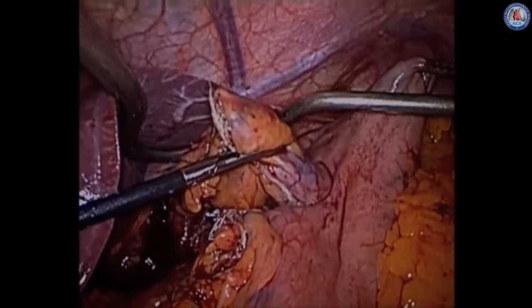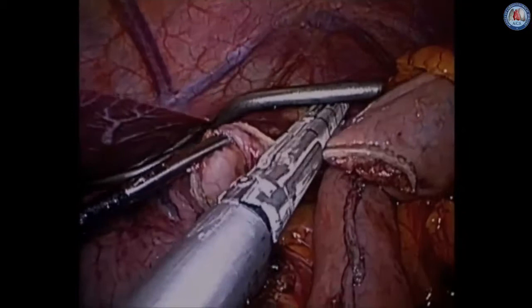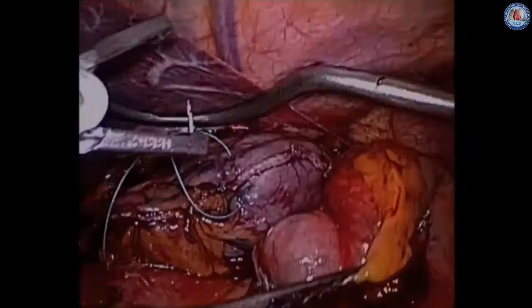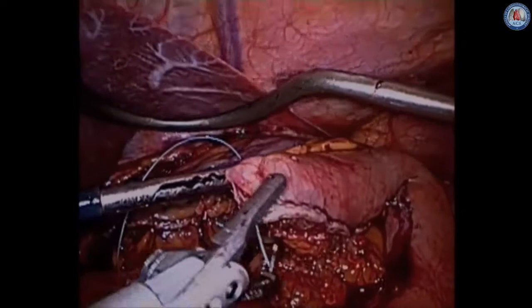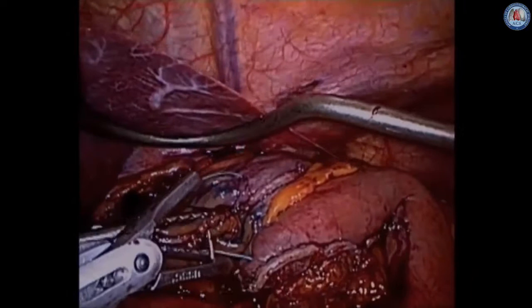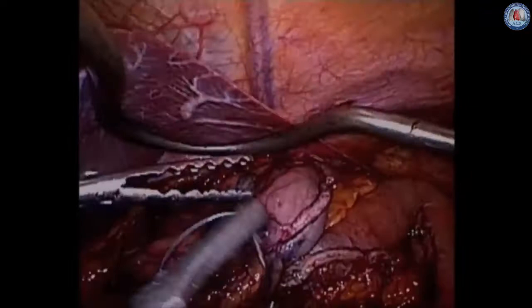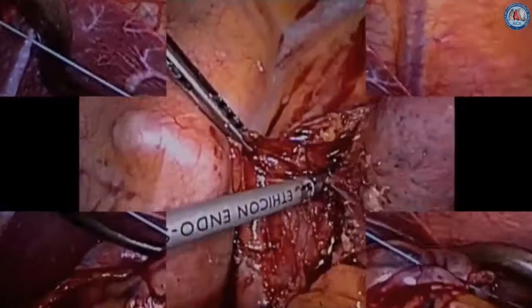We form our gastric conduit in multiple fires of the stapler, making sure we have about a 4 cm diameter from the greater curvature wall to our staple line. We put some retraction on the stomach to make sure that the conduit itself is extended. Usually it takes about seven to eight staple loads to go across the entire length. We then attach the specimen to the tip of our gastric conduit, making sure of the orientation so that the staple line remains on the right side, verifiable once we pull it up into the chest. Usually two sutures are placed to maintain orientation. Once tied, we check our conduit one more time before proceeding up into the thoracic cavity.